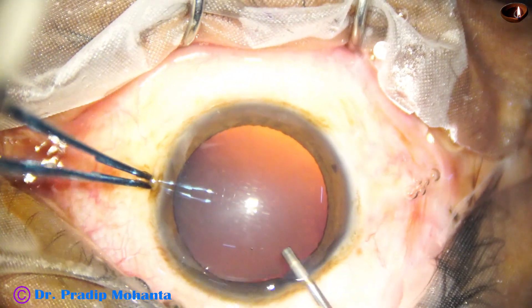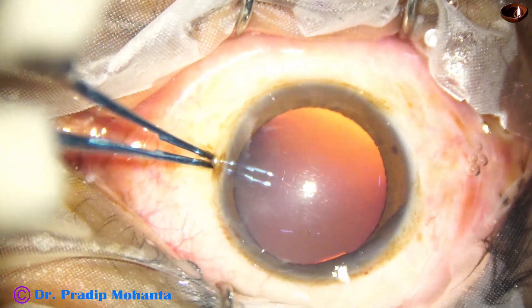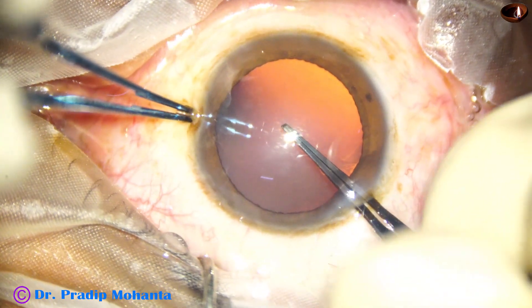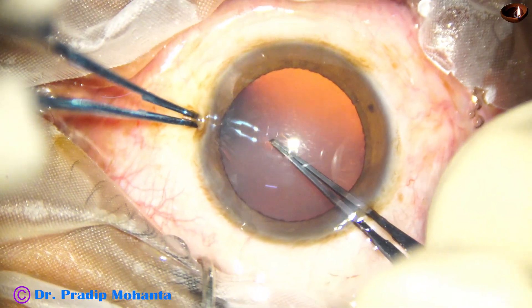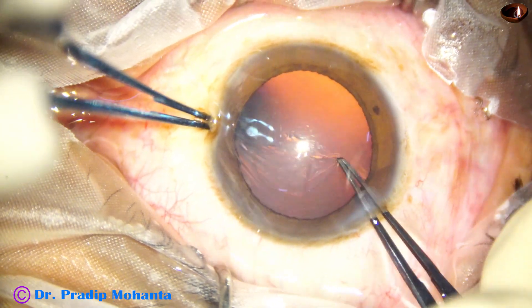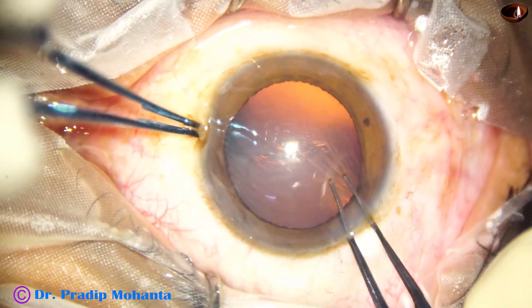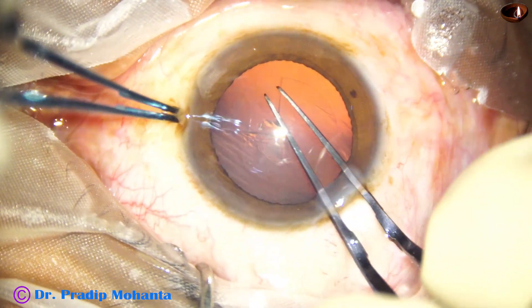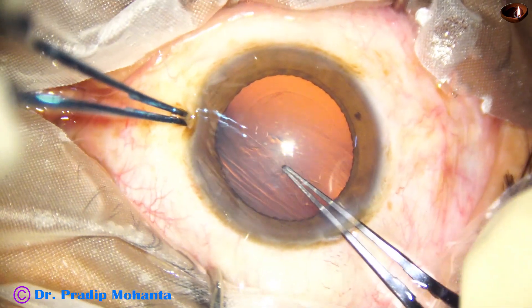And now capsulorhexis is to be done. I take Utrata forceps, make a puncture at the center, raise a capsular tag, guide this tag all around anticlockwise and do a continuous curvilinear capsulorhexis.